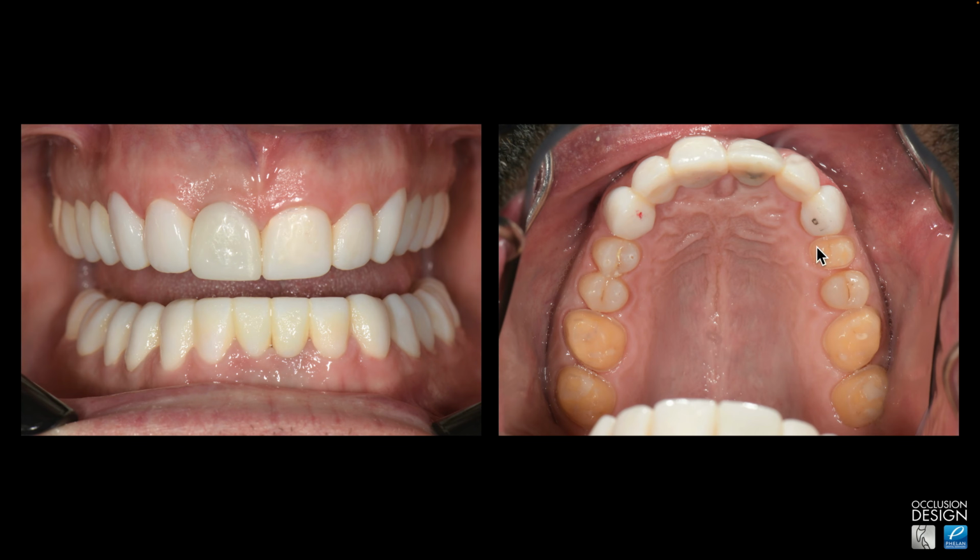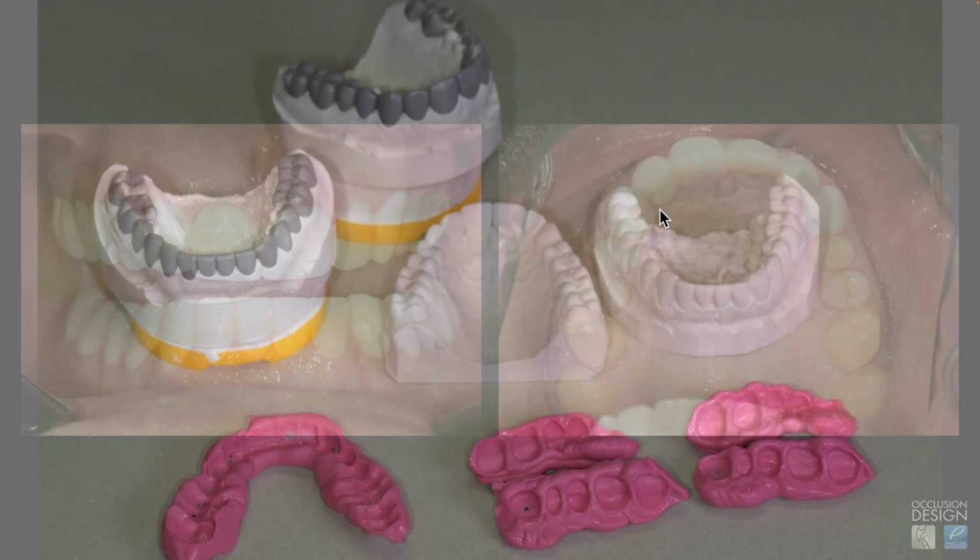I take off the upper posterior provisionals, and I basically have the patient bite down. You've got solid contacts on the cuspids that you can see in the bites, and your bite is at the vertical dimension that you want to build the case at. And because there's no posterior contact, it's an open, basically Lucia jig type of bite in CR. So the anterior provisional is acting like a Lucia jig to build the bite, or a deprogrammer.